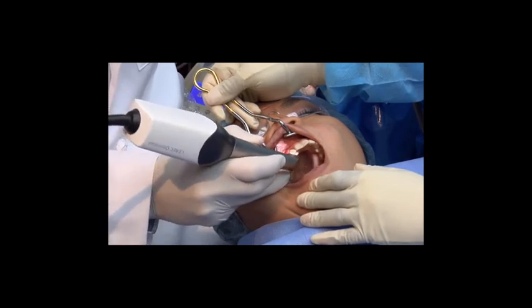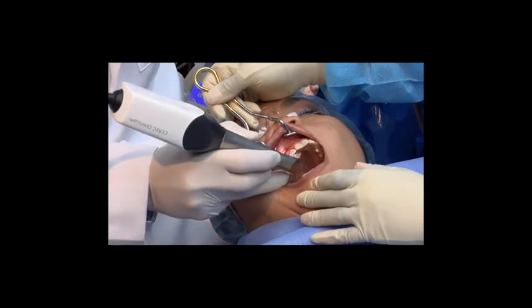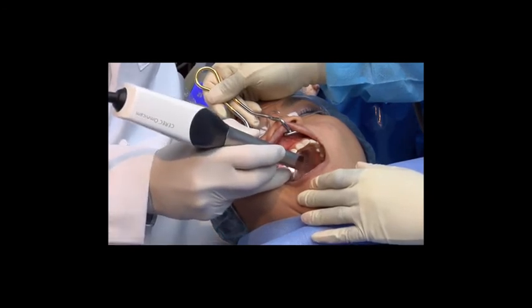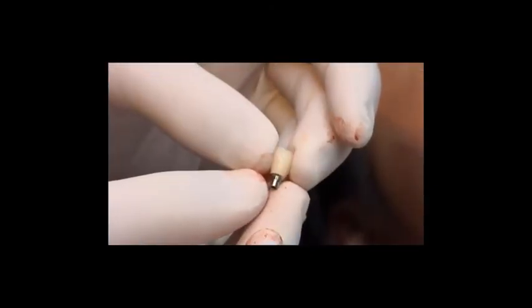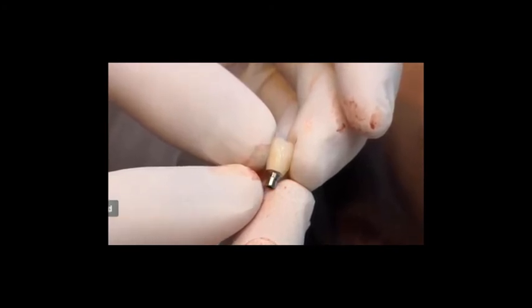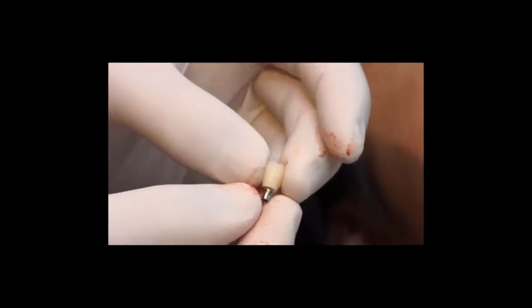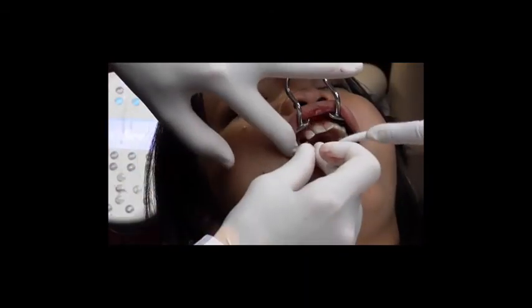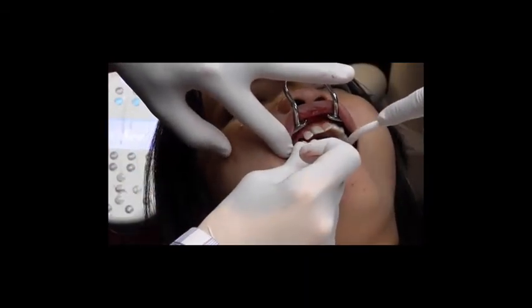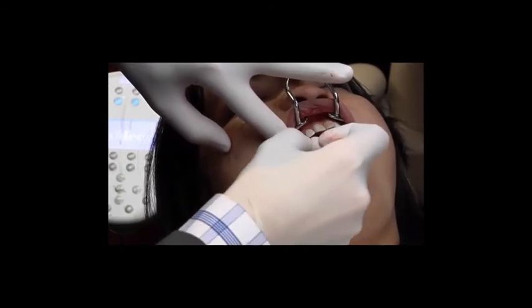So here's the scan that is being done, and obviously the apical area is sutured, and now we just scan the scan post and scan body. Once that is done, then we go ahead and design and mill a TeleoCAD restoration, in this case, that is then bonded to a tie base, Straumann Vario base for CEREC in this case. This process takes about an hour with the designing, milling, polishing, bonding to the tie base. The patient can wait in the meanwhile, and once that is done, now we can go ahead and seat the restoration kind of immediately.